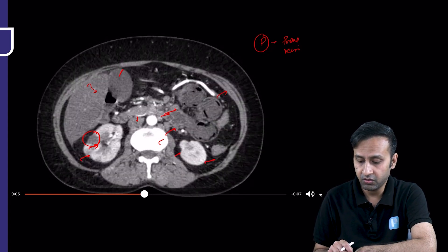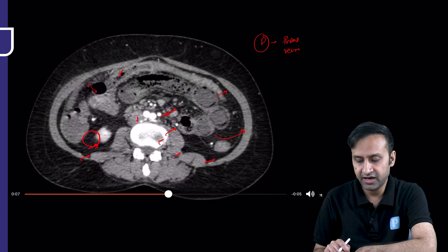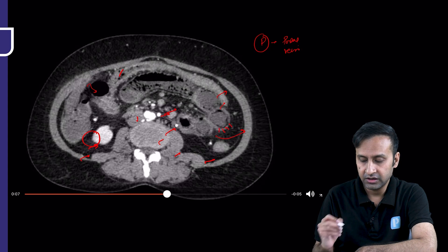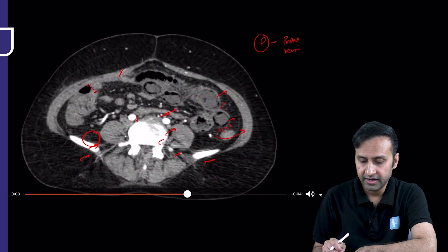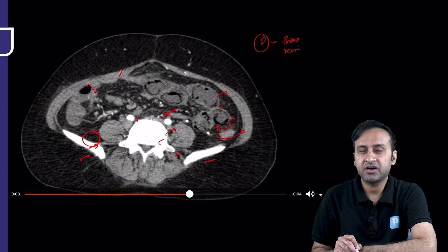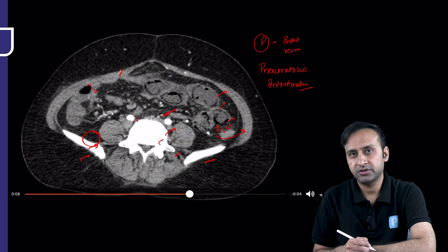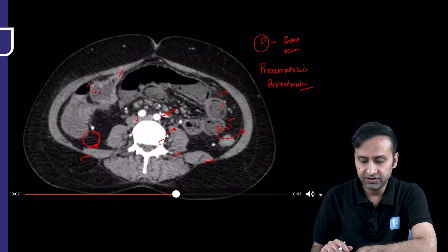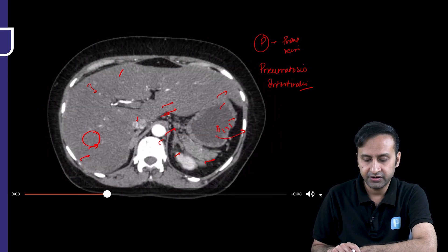Now look at the bowel — it is showing a very characteristic sign. Air is seen in the non-dependent part, which is expected, but if you look carefully, air is also located along the dependent part. Air should never be seen in the dependent part of the bowel wall. This appearance — air within the bowel wall in the non-dependent and dependent walls — is called pneumatosis intestinalis. In the small bowel, pneumatosis intestinalis is always pathological. In this case, the SMA is almost completely occluded, confirming we are dealing with mesenteric ischemia.